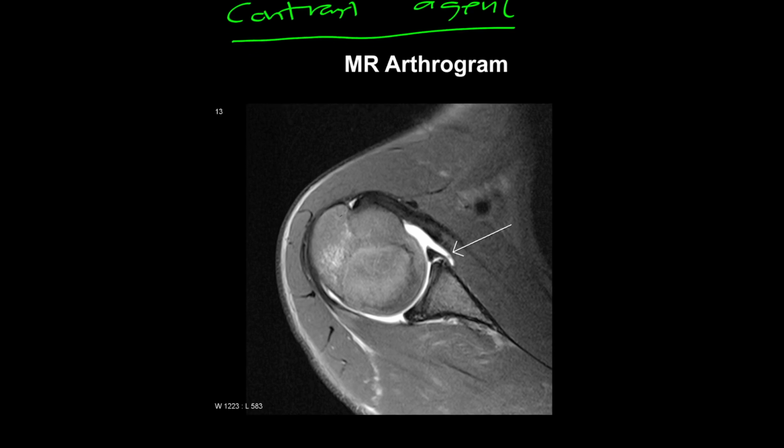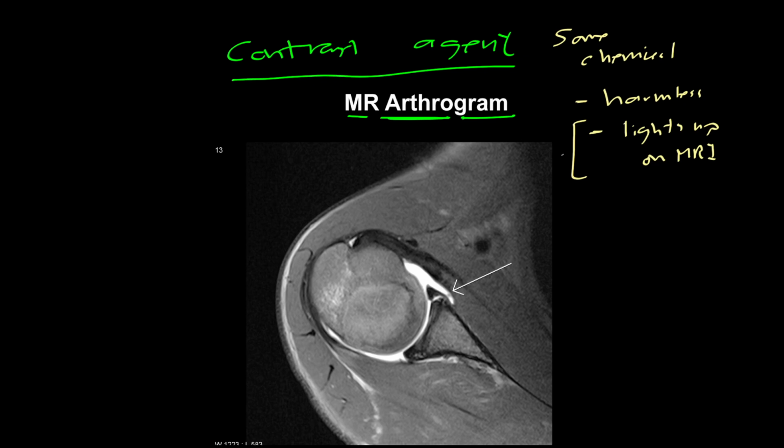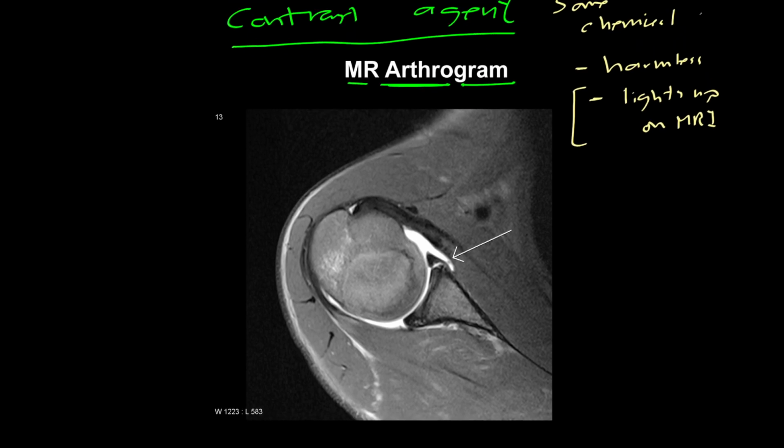If you want to image the inside of a joint, you can do something called an MR arthrogram. Arthro means joint, so like arthritis, right? Joint inflammation. Gram, like image, Instagram, image focused also. So magnetic resonance joint image. How this works is you use a contrast agent, and a contrast agent is just some chemical that has 2 properties. Number 1, harmless, for reasons that will become obvious soon. And number 2, lights up on MRI. And why a particular compound would do this has to do with how the hydrogen in the molecule is set up, but those are technical details that aren't really important for our purposes.